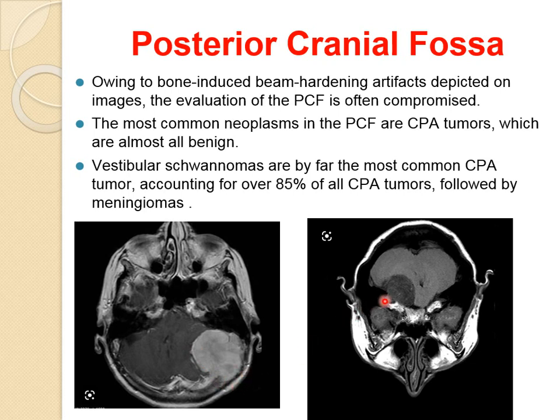This is schwannoma. Why is this schwannoma and this is meningioma? It's a dural-based lesion. And you can see the homogeneous post-contrast enhancement and the mass effect on the adjacent cerebellum and brainstem, and you can see it's related to the venous sinus here. So it's a typical meningioma.